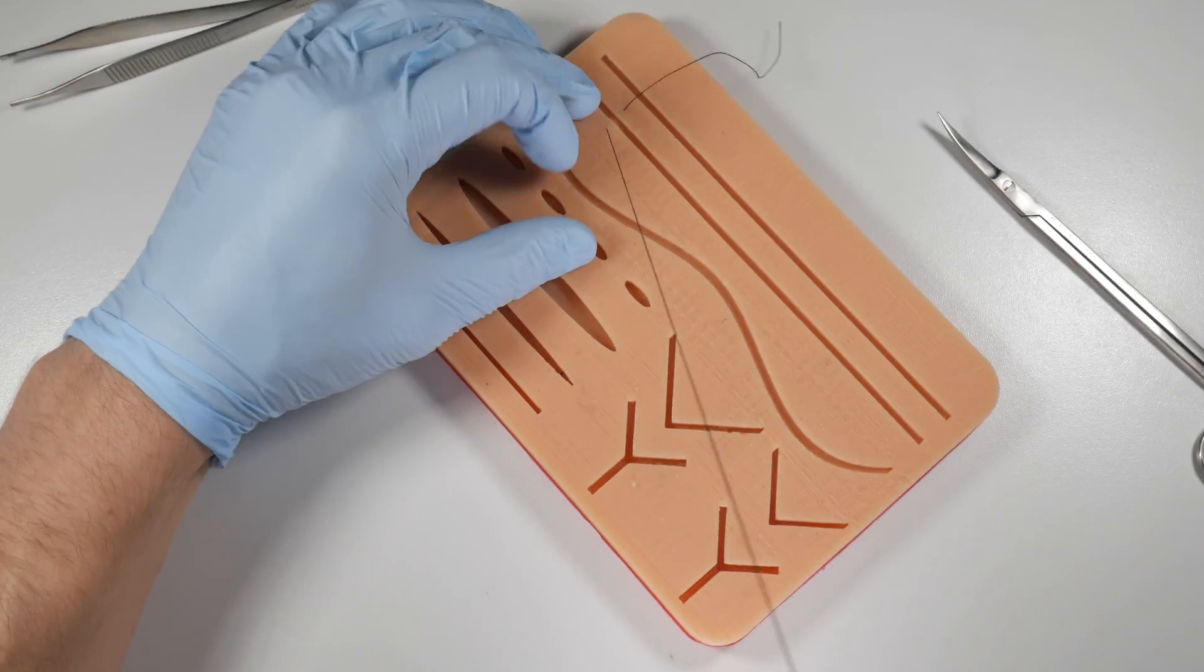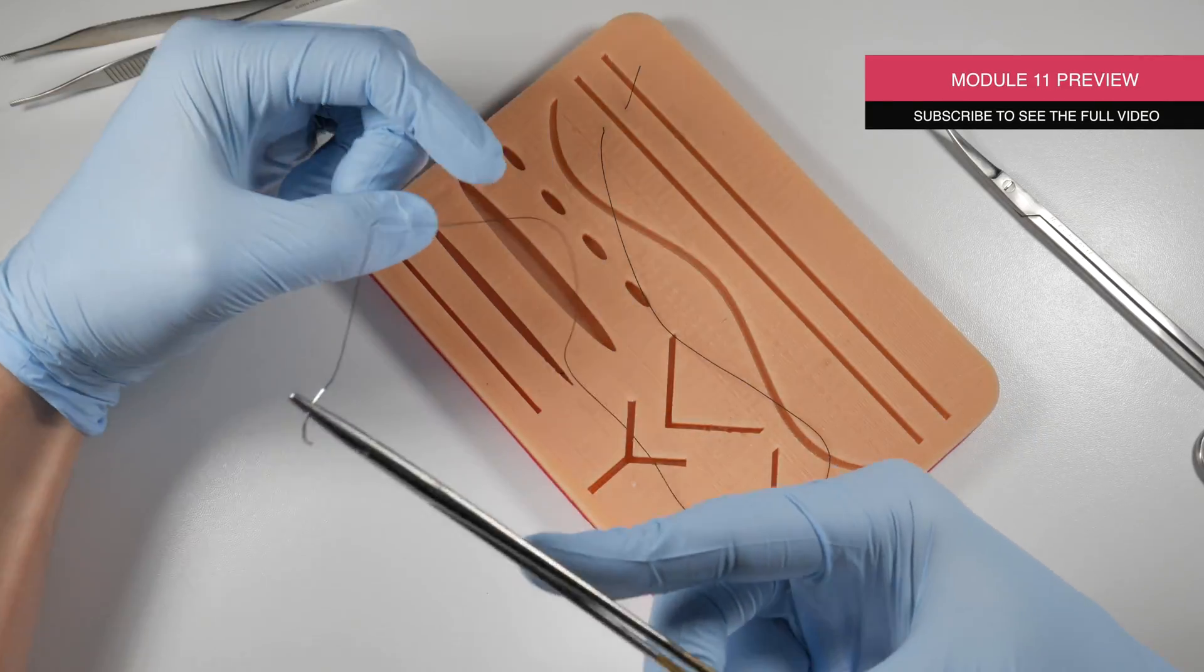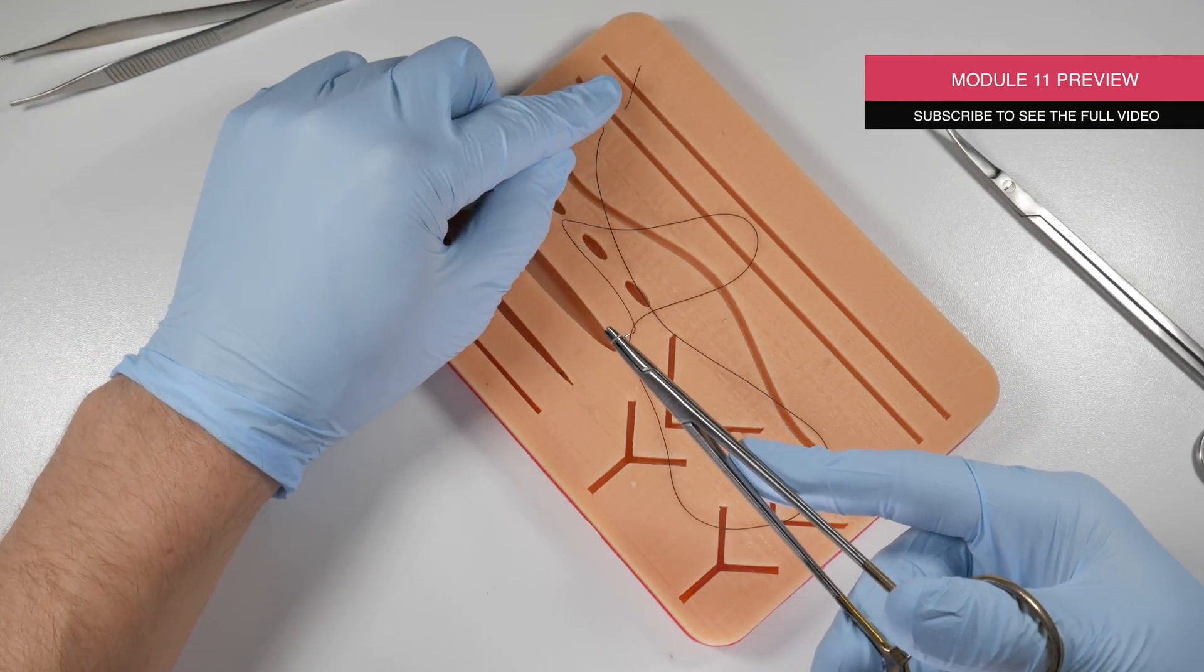We should have a long end and a short end, probably about this much left hanging out. Once we pull this through, that might be about an inch or a little bit under.